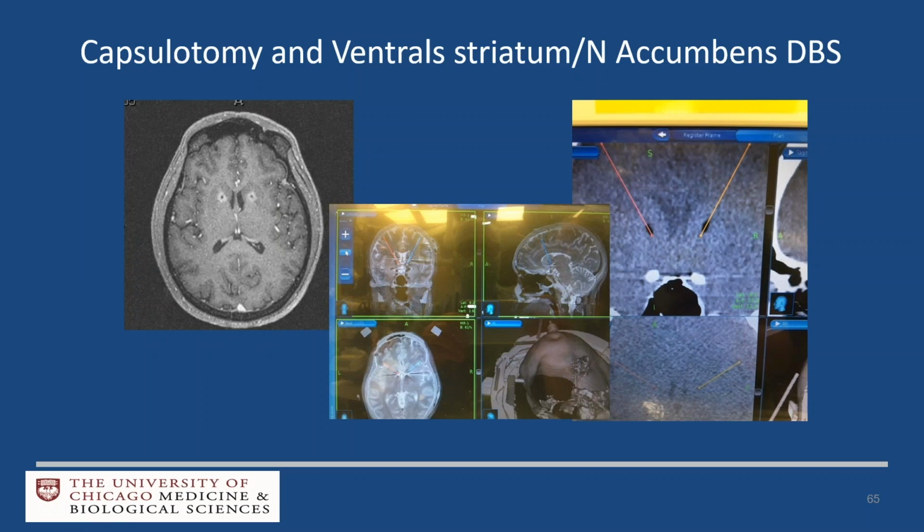We, as you might know, are the OCD FDA reference center. So we see a lot of OCD patients which either get treated with striatal depth DBS, covering the shell of the nucleus accumbens and the stria terminalis, or with an anterior capsulotomy, which we actually do with interstitial laser now. And again, you can see that your DBS electrodes, or in this case, the laser fibers on the right upper panel, are exactly where you calculated them to be with a superimposed trajectory.